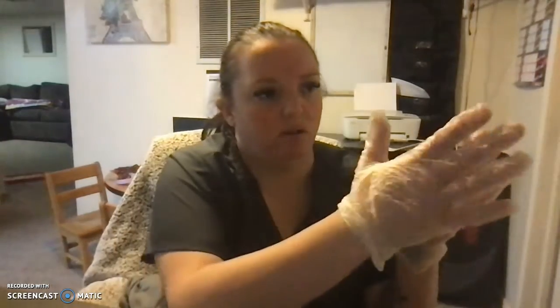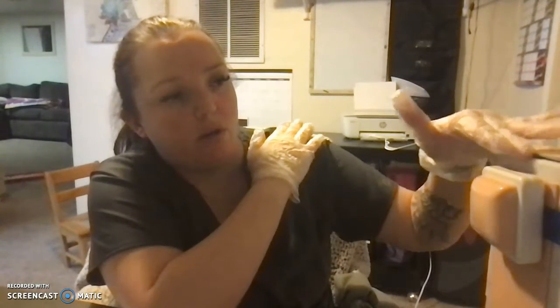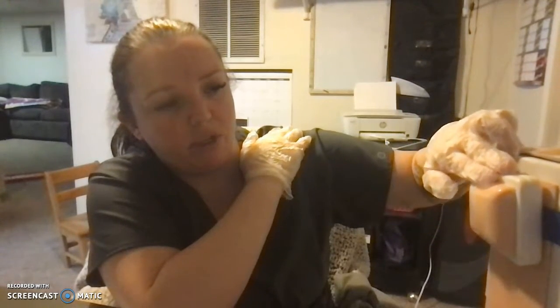And then I will locate on my patient where I'm going to give the injection. So on my patient, I would give the patient the injection in the deltoid muscle. So this is my patient's arm, and this is their shoulder, like up here. I would locate the acromion process about 2 finger widths down.